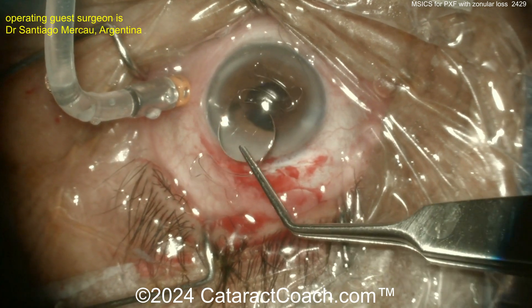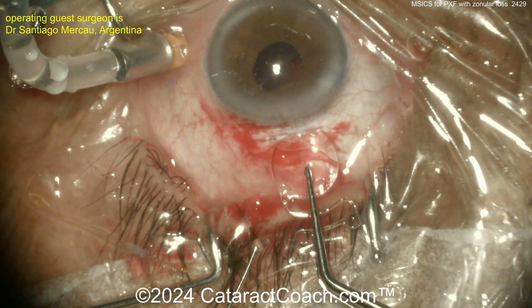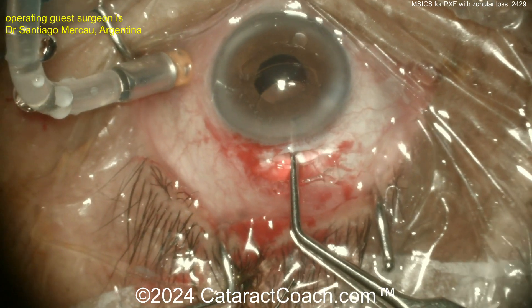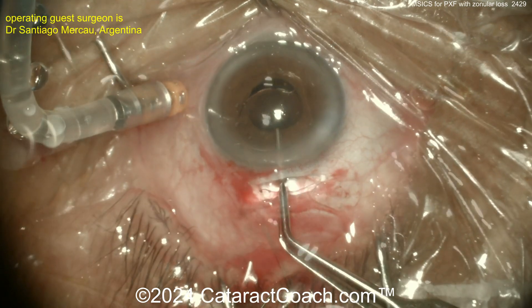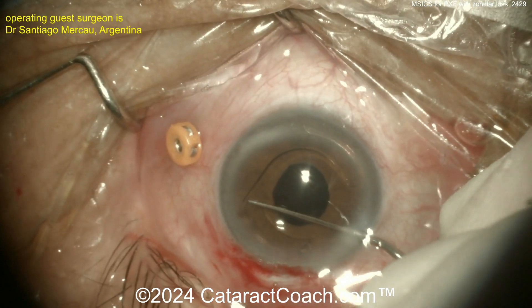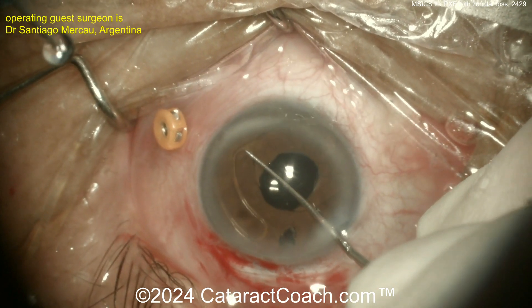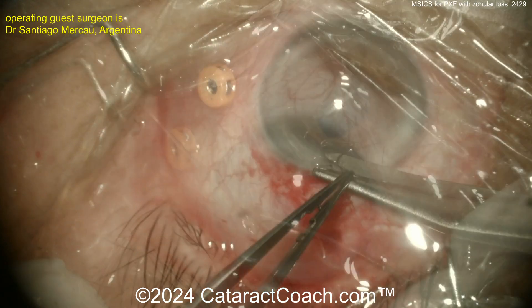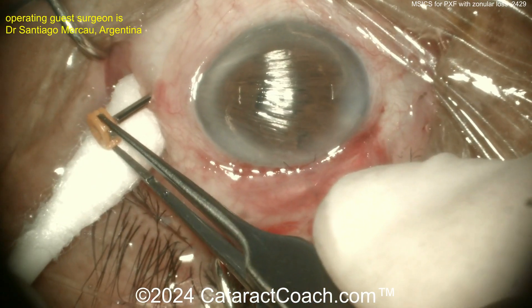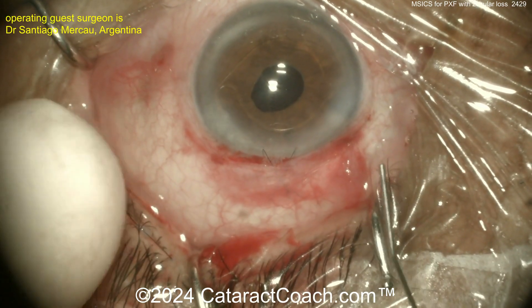Once all that's cleaned up — AC IOL, anterior chamber IOL. You may not think it's as cool as a scleral-fixated IOL, but in meta-analysis it is shown to be equally effective, and you already have a large incision from removing the nucleus. Look how round the pupil is — that tells you the footplates are in the correct orientation. Slowly rotating it, getting it nicely positioned. These are angle-supported lenses, so measure white-to-white and add about half to one millimeter for appropriate sizing. Now suturing up the incision and removing the pars plana port.